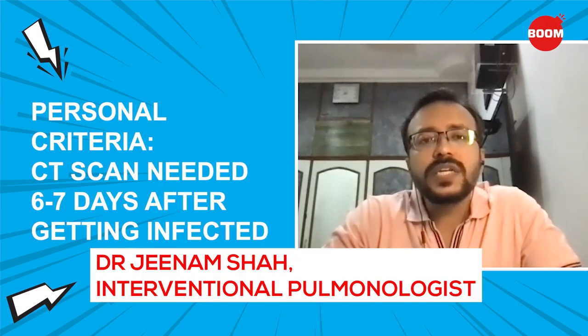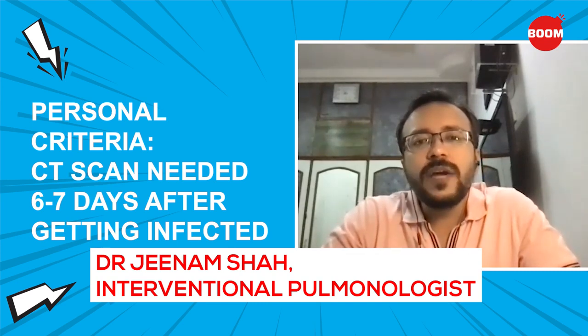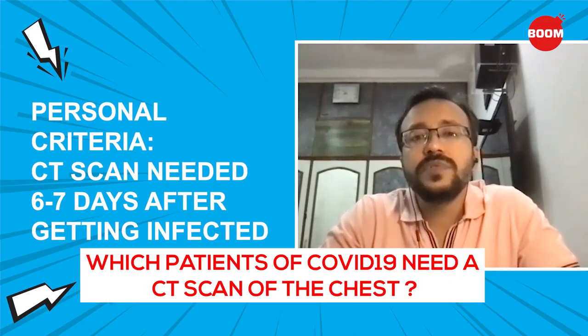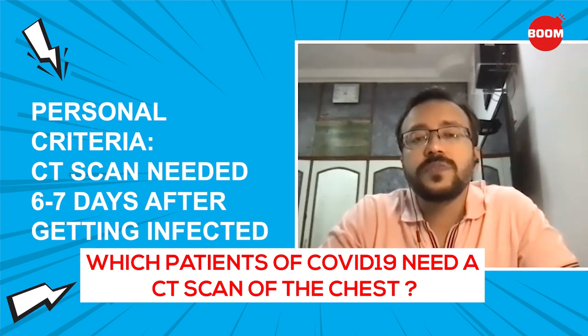So if you do a CT scan initially in the first 5 days, the CT scan might show normal changes or it might show very mild changes. You might be fooled into thinking I'm having a very mild COVID and do not need to be hospitalized, but that is not the case. The CT scan starts showing some changes after day 5, day 6, and the ideal time would be around day 7, day 8, when you are suspecting whether the COVID is severe enough to be hospitalized or not.